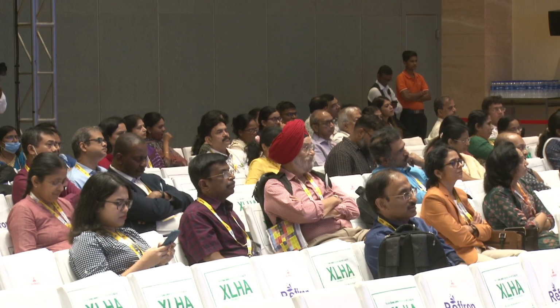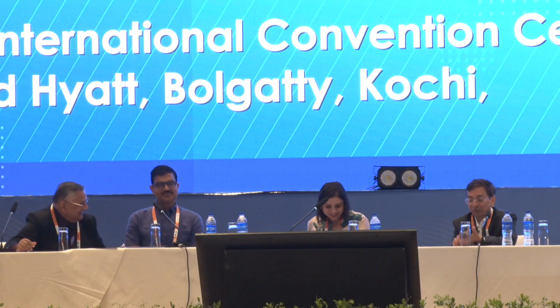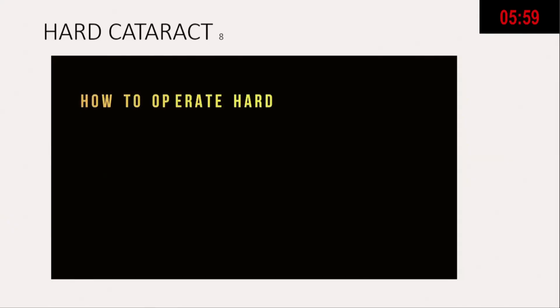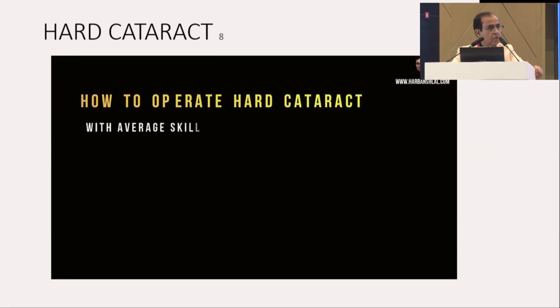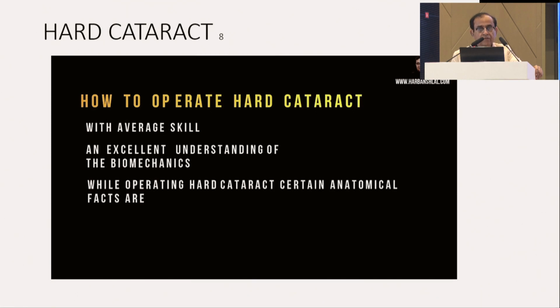Going to highlight some special tips for managing the hard cataract. Today I am going to talk about how to operate hard cataract with average skill and excellent understanding of the biomechanics. While operating hard cataracts, certain anatomical facts are to be kept in mind.